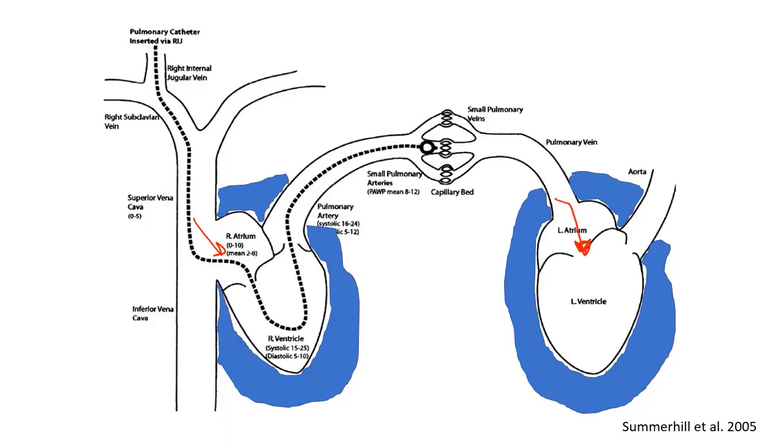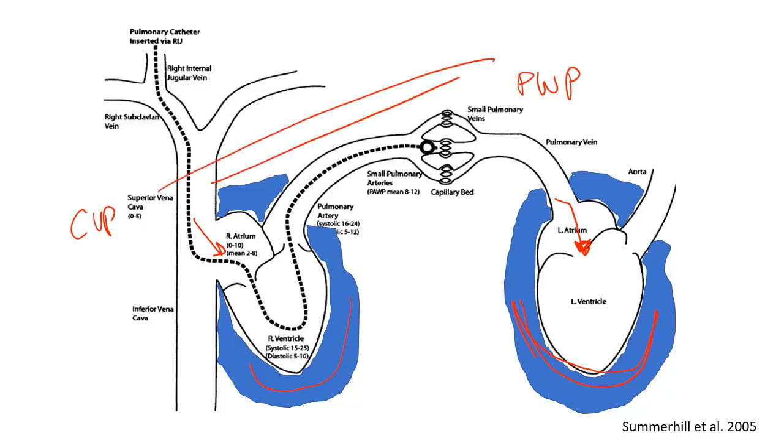Now, why do these two equal each other? The reason is when you get blood around the heart, that pericardium is going to restrict the filling of both ventricles, and you get equalization of those filling pressures because they can't fill anymore. That's limited by the pericardial fluid. And so the limitation of everything is not the systolic function of the right ventricle or the left ventricle, it's getting blood into both of those. And if the pericardial pressure is the same throughout, then the filling pressures, your pulmonary wedge pressure and your CVP, are going to be the same.